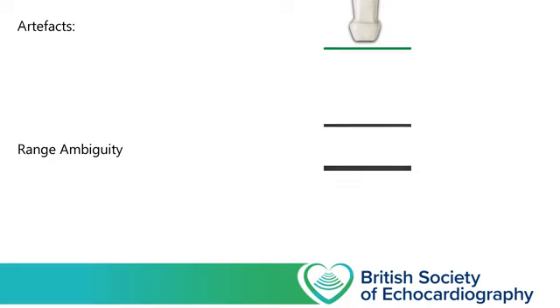So let's imagine that we're imaging our patient and these two grey structures here represent reflective surfaces within the patient. The first is 10 cm from the probe, and the second is 12 cm from the probe. So we start firing our ultrasound waves into the patient, and the first wave that reflects off the first line travels 10 cm into the patient, 10 cm back to the probe, and has travelled a total of 20 cm. So when the ultrasound software displays this on our screen as a structure, it estimates that this structure must be 10 cm away from us.